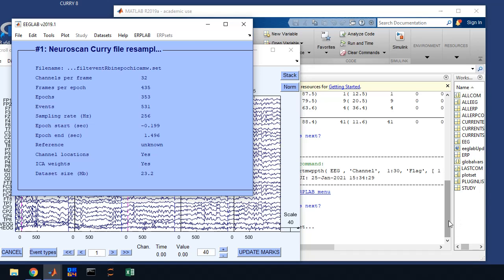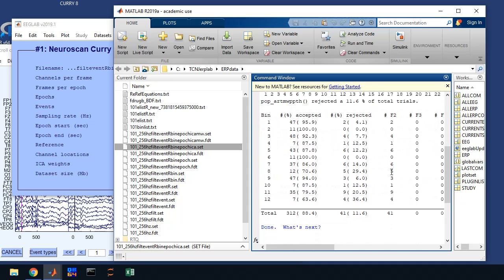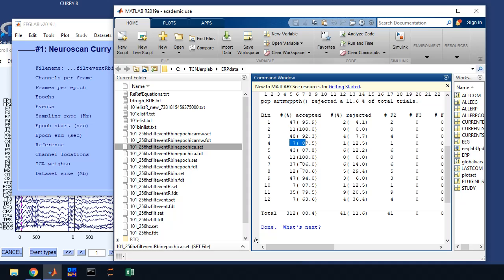So when it ran the algorithm, it shows you all of the bins here. So these are the bins that we have sorted. And what we're looking for is the number of trials in these bins are above 16 or so. You want 16 or so trials to have a good ERP. Some of them are kind of low, but that's okay because they may be error trials and we're not necessarily going to have ERPs for each subject for error trials, for example. So in the protocol, specify which bins you should pay attention to and which bins should be greater than 16 for us to include that person in our data set.